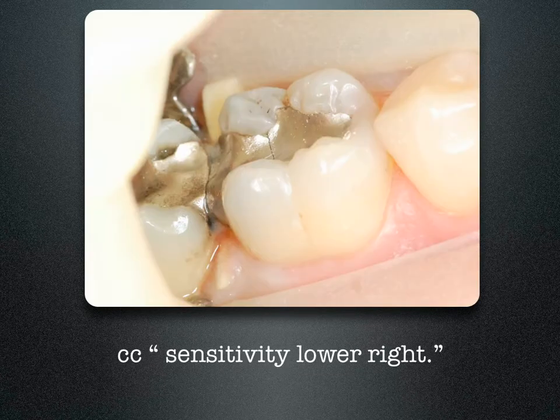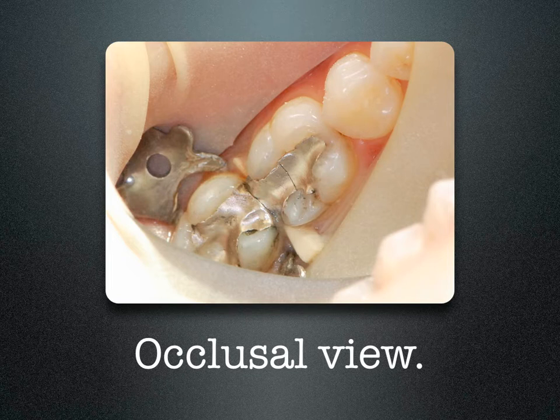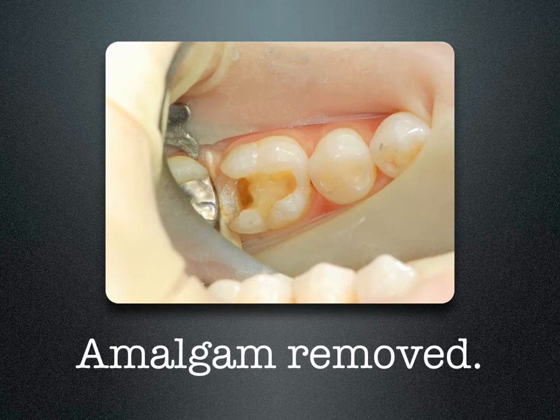Andrew presented to my office with sensitivity in the lower right molar. Tooth number 30 has a fracture in the amalgam. There's the x-ray. As you can see from the occlusal view, there's a fracture going through the middle of the occlusal amalgam. Once I remove the old amalgam, you can see that there's an extension of the box. This is not a conservative lesion and a difficult Class II restoration.